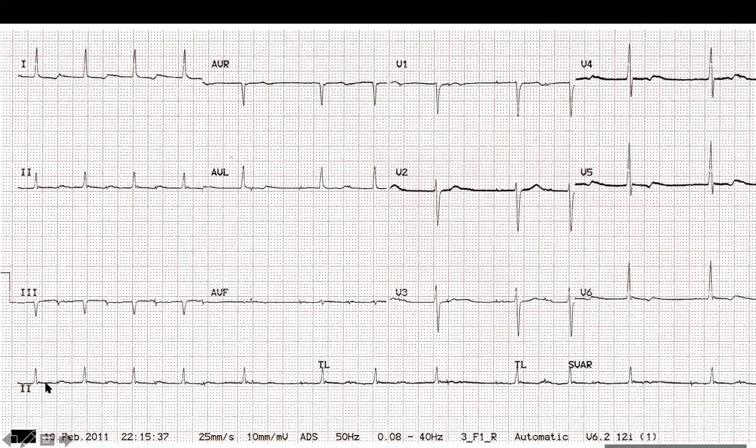Okay, so I'll just go back here. You're doing very good, but I'll try to put it all together. So here we have a spike followed by a P wave. Then the AV delay is long, almost 300 and something. Then the native QRS. Then here we have a pacing spike, a P wave, and a very long PR interval, almost close to 400. So the PR interval in the second beat is longer than in the first. Yes. Then the QRS.